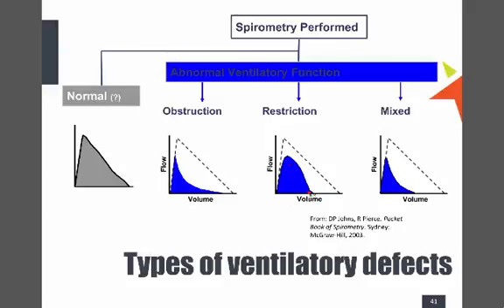I haven't got the scooping. That's where this one is different. Out it comes, but there's just not the volume. And this one is a bit of a mixed picture in that I've got some coming out, and I've lost volume too. So we'll talk about those and what type of conditions go with those flows. But hopefully that's making a bit of sense.